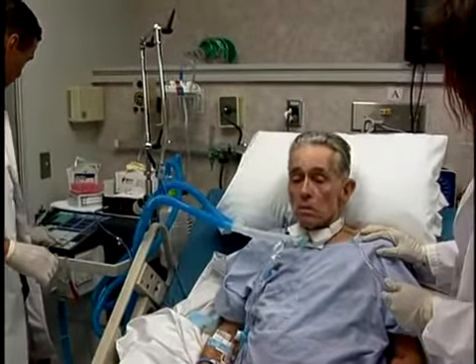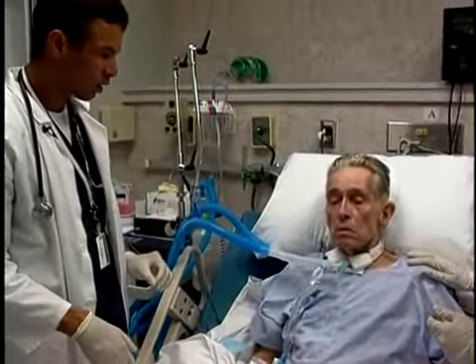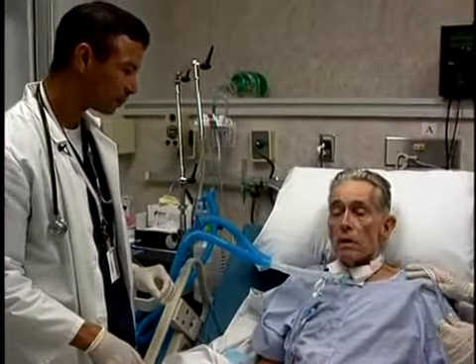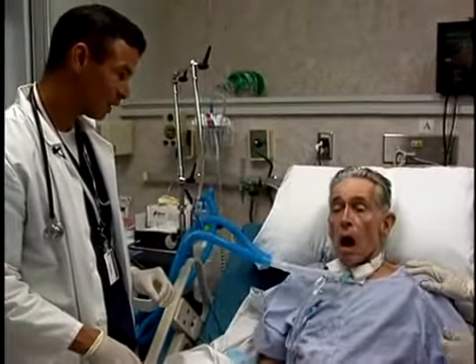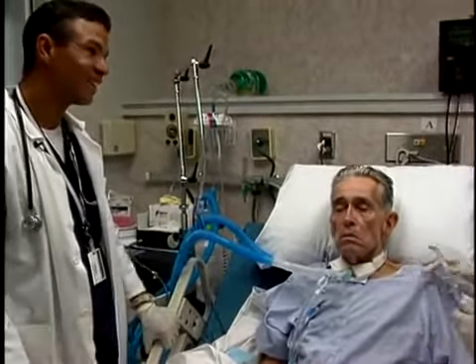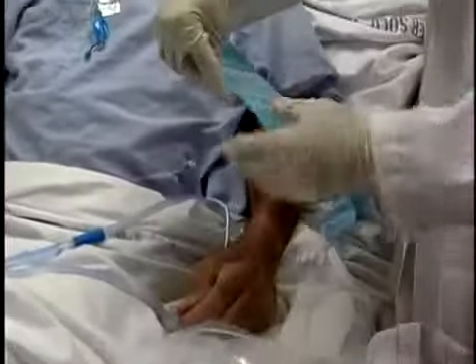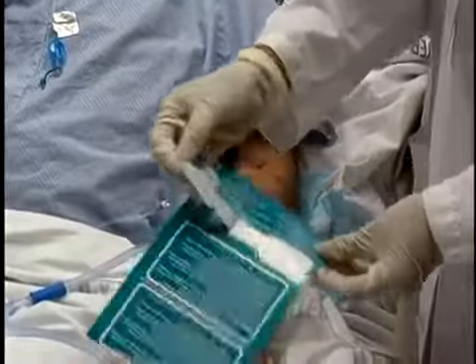When the patient has acclimated, assess airway patency. Encourage vocalization to determine if air is able to pass around the tracheostomy tube and through the upper airway. If the patient is having difficulty redirecting exhaled air, reassess for airway patency. Now that the cuff has been completely deflated and the patient is ready, the valve can be placed in line.